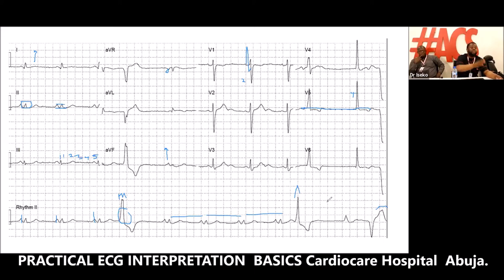Sometimes all of them can look alike. We call them unifocal. Now we also say that the heart rate here is 60. We say it's a normal axis. We say that there is ST depression in the lateral leads, slightly indicating lateral ischemia. And we say that there are low voltages in the limb leads.